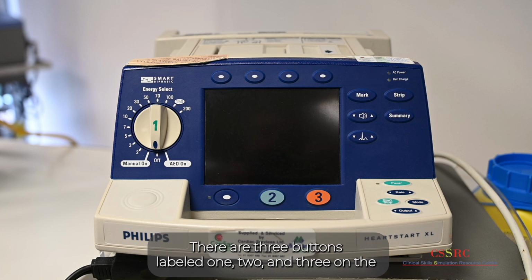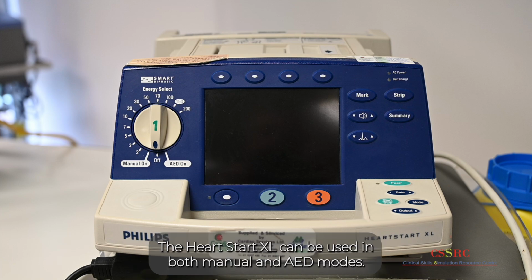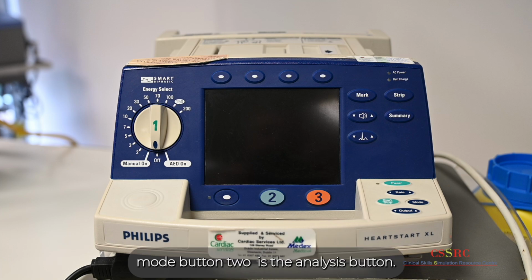There are 3 buttons labelled 1, 2 and 3 on the HeartStart XL. Button 1 controls power and mode selection. The HeartStart XL can be used in both manual and AED modes. Certified BLS providers must always use AED mode.